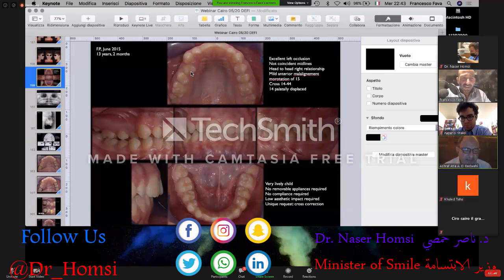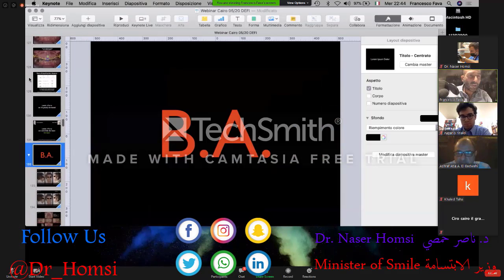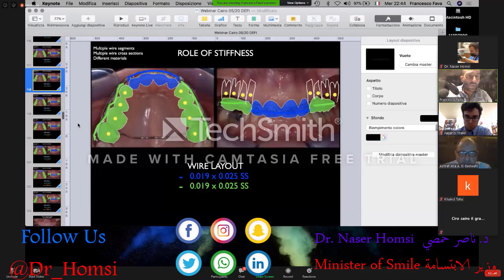Dr. Fadi Fahim asked, what is the material and wire size of the transpalatal arch and lingual arch? Thank you for the question. There are two main options. The first option is 0.036 stainless steel, which is very stiff.